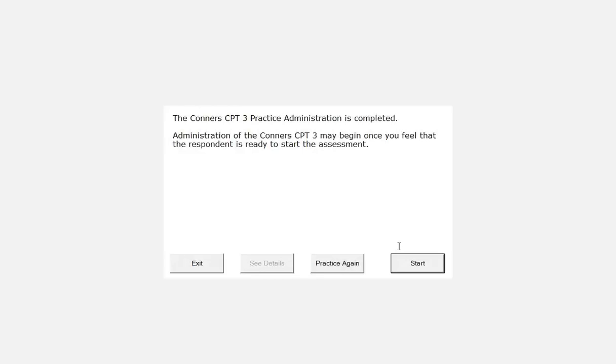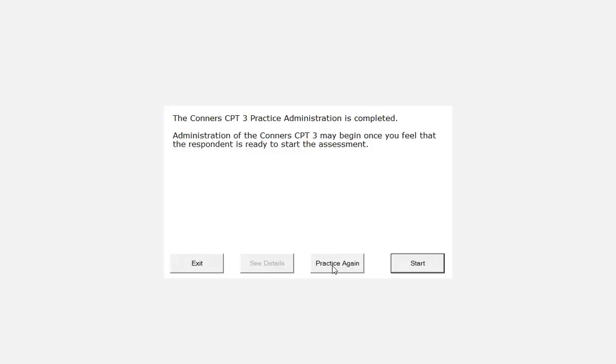The respondent should proceed to the actual administration if no warning message is issued at the end of the practice test. If a warning error is issued, it is recommended that the administrator choose the practice test again and re-explain the instructions to the respondent before repeating the practice test. If task comprehension does not improve after three attempts, consider foregoing the actual administration.